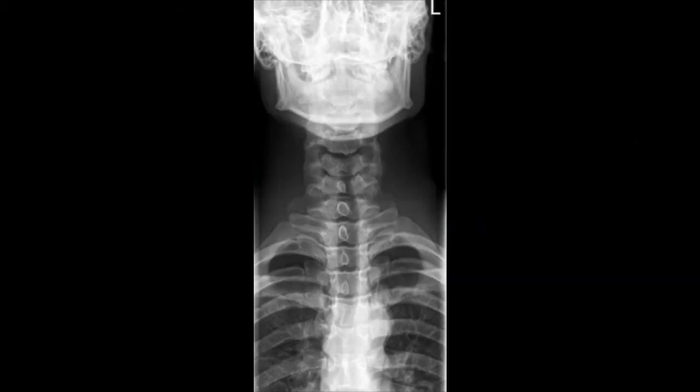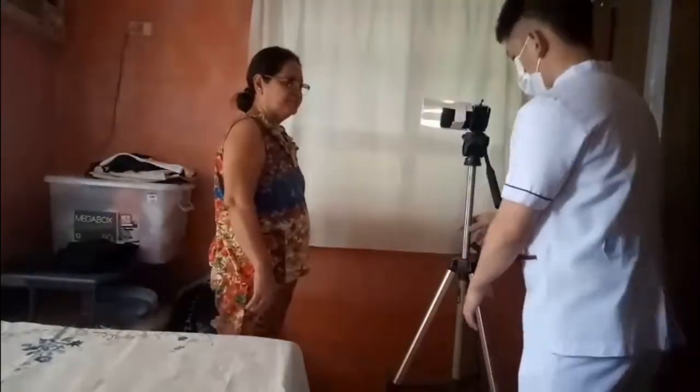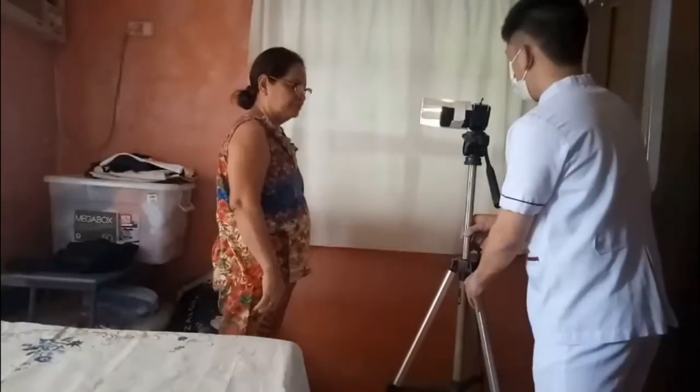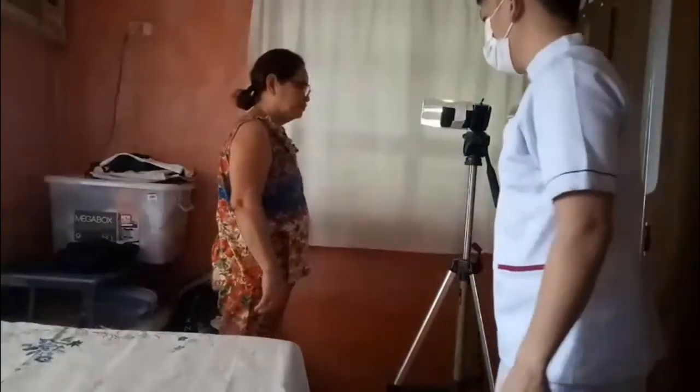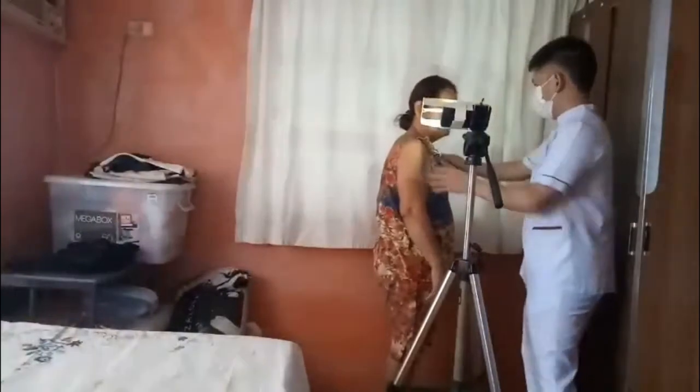The structures shown are the resulting images of the lower 5 cervical bodies and the upper 2 or 3 thoracic bodies. Lateral projection, Grandy method. An SID of 60 to 72 inches is recommended because of the increased object to IR distance. A longer distance helps show C7.